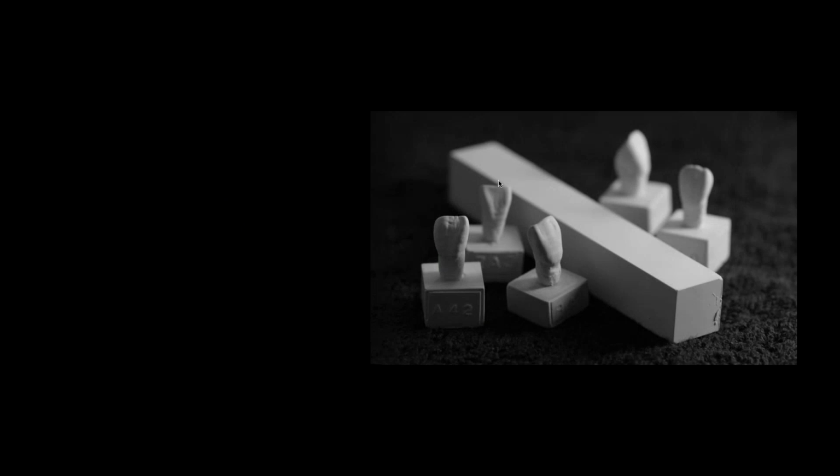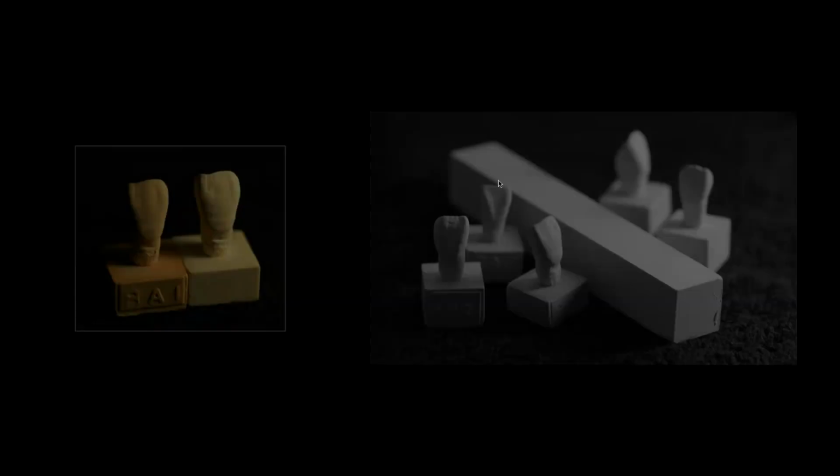It's an exercise not with wax, it's an exercise of carving. When you're carving the natural tooth from a block of stone, it is a little bit more difficult exercise. Why? Because there is no room for mistakes. If you remove some part, you cannot add it back like wax. So it's a different type of practicing, but more difficult, of course.